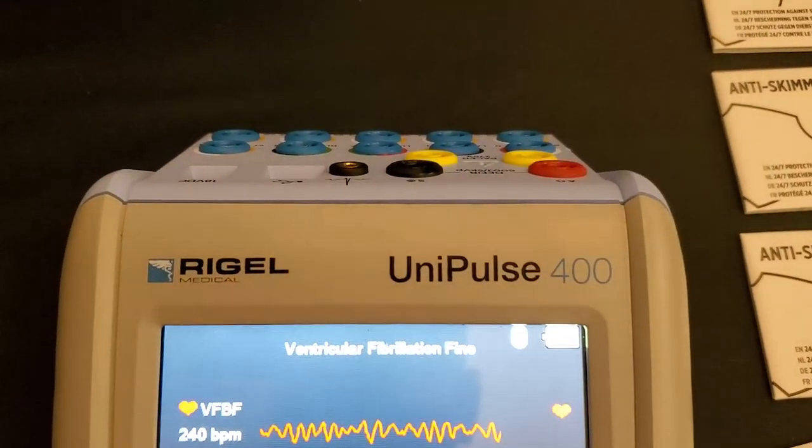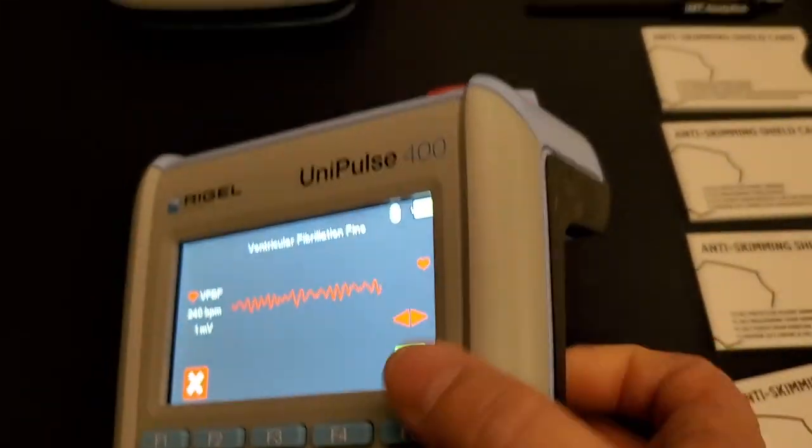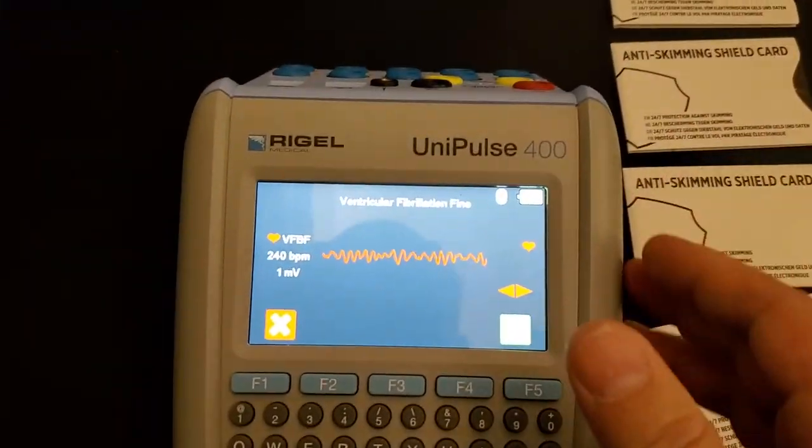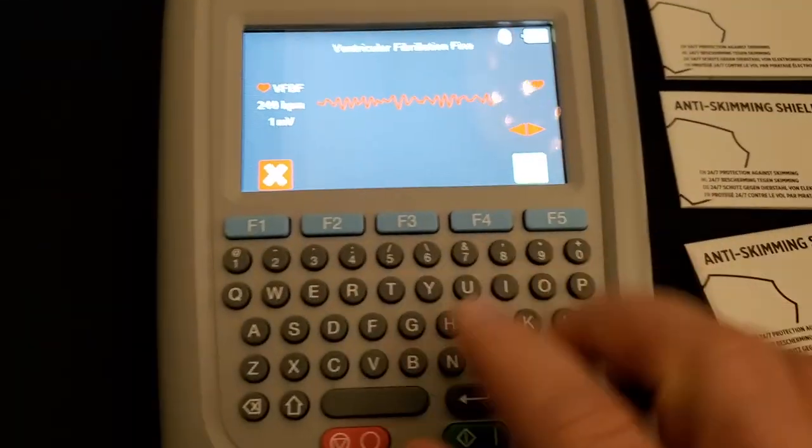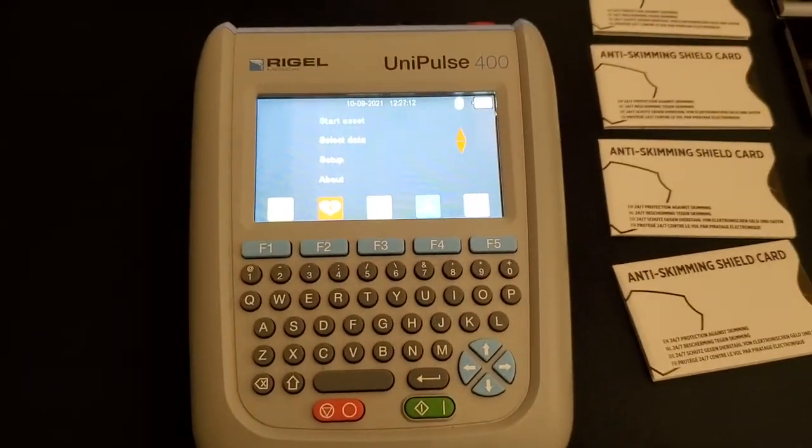Anyway guys, that's the Rigel Unipulse 400, battery powered. I just happened to see it as I'm walking by and I thought I better grab that while I can. What a cool little device. Thanks guys.